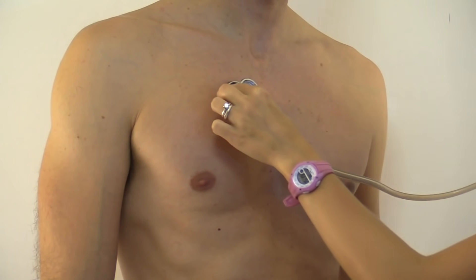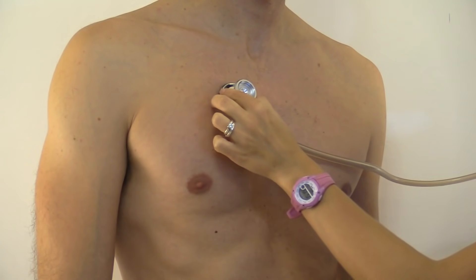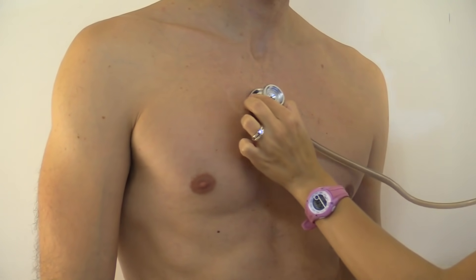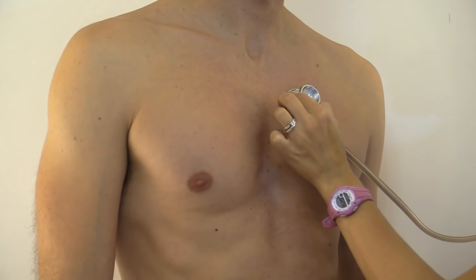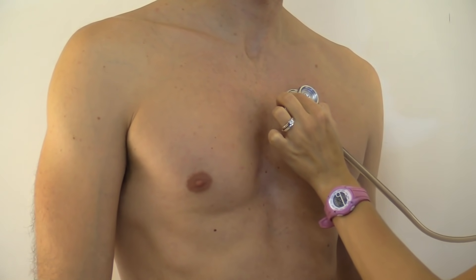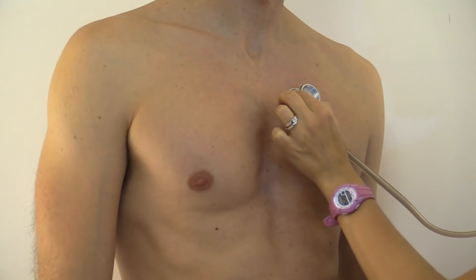Then we're going to go a little bit over to where the pulmonic valve is found — on the left of the sternal border at the second intercostal space. Again, just listening to lub-dub, and S2, the dub, is going to be louder in this location.